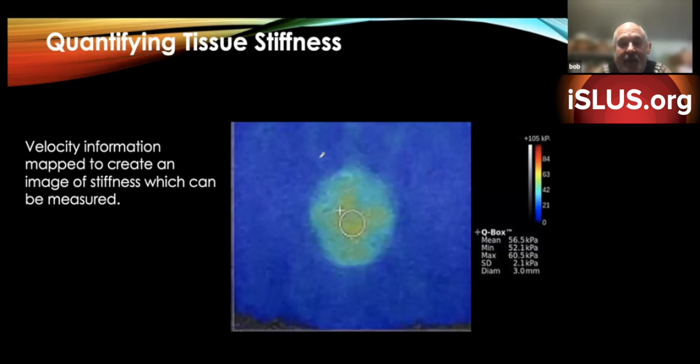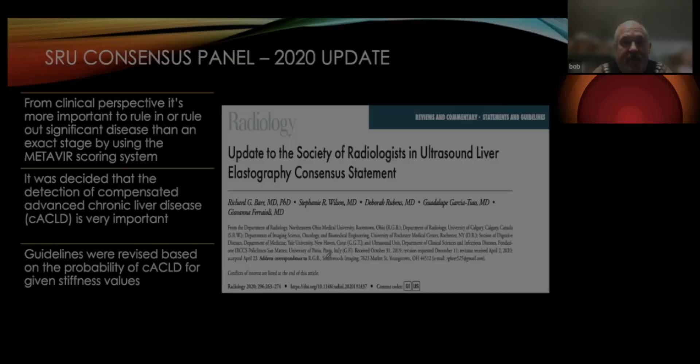We also have color maps to help guide us. We can see the color range here — mid-range colors indicate normal tissue. This visual map helps us make sure we get the highest measurement from the right location, so we don't place the cursor where values are really low, or where it's encompassing both normal and fibrotic tissue and giving us more of the normal tissue reading. This is a big help in really placing where we want to get that information from.